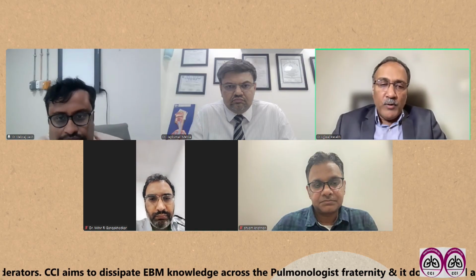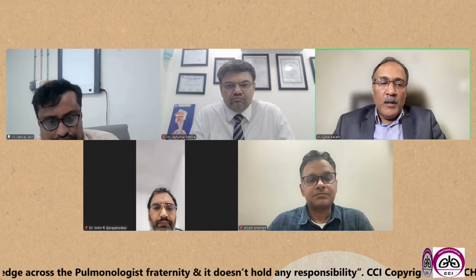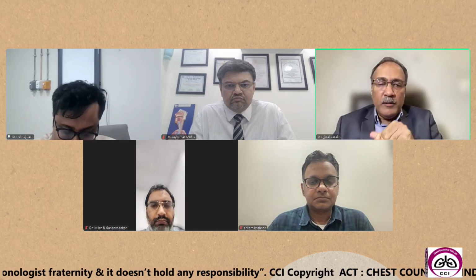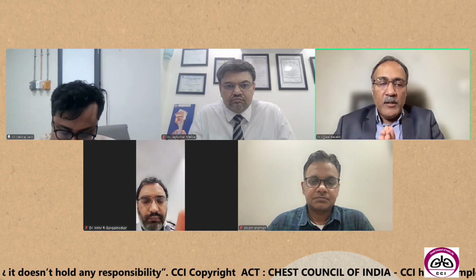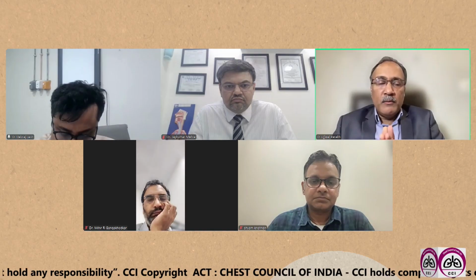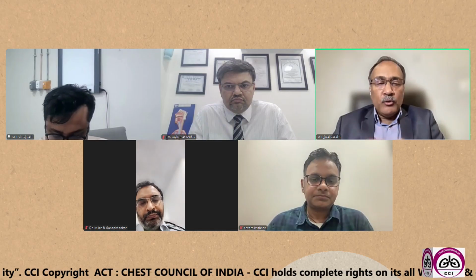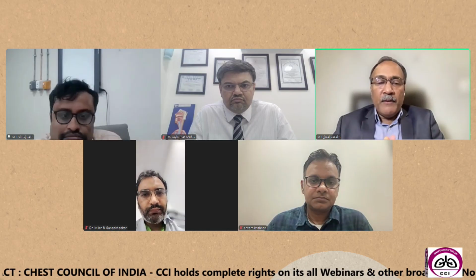Thank you very much. Well, anesthesia is very, very important, especially when you are beginning to do the EBUS. The reason is that whenever you are trying to identify and then make a puncture into the lymph node, if there is too much respiratory movement or coughing, then you might injure the patient or damage your scope. So especially in the beginning, you should be doing it with the help of anesthesia people, in deeper sedation or through an LMA, so that the breathing pattern, as well as the depth of breathing and coughing, is controlled.